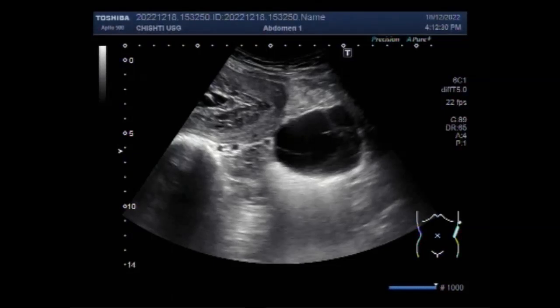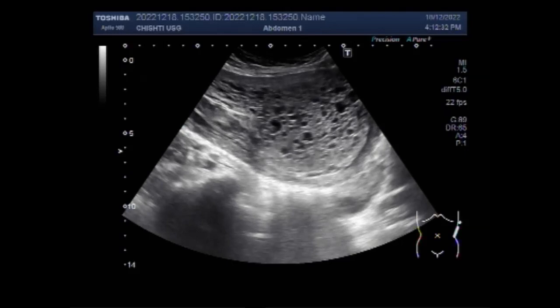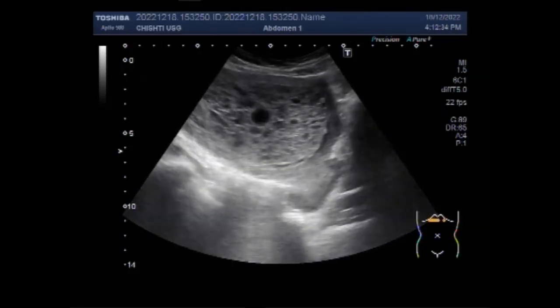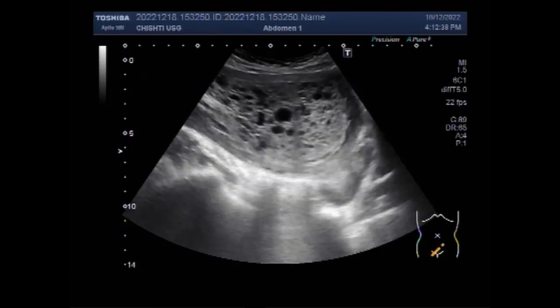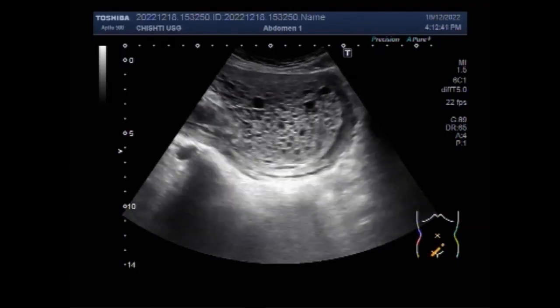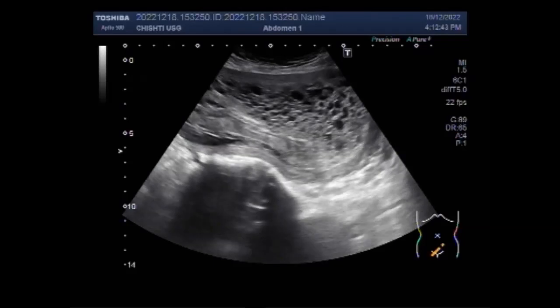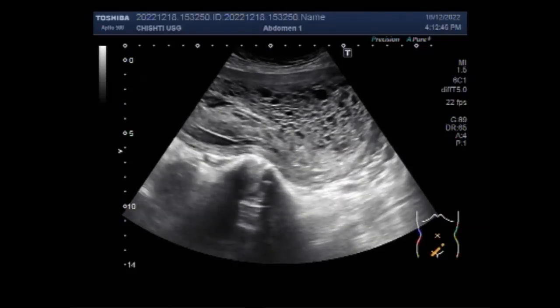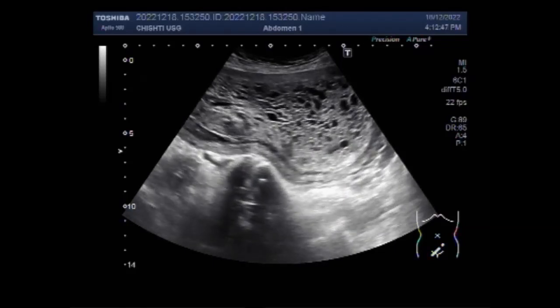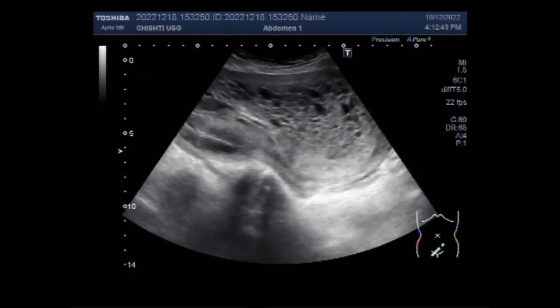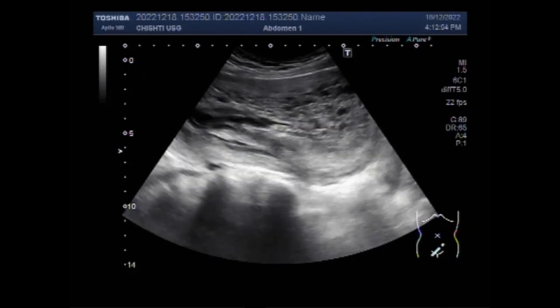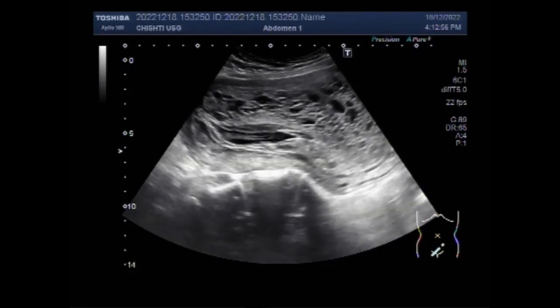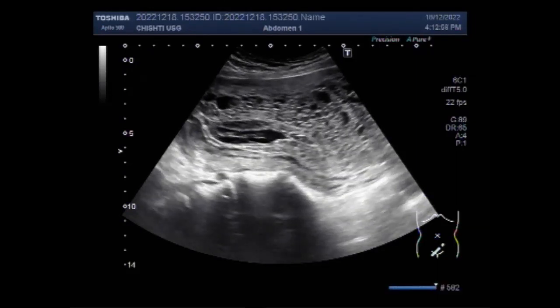Dear viewers, I hope you are all fine. This ultrasound video shows a case of complete hydatidiform mole, also called molar pregnancy. You can see the scanning of the uterus, and the whole length of the uterus is filled with this molar pregnancy from the cervix to the fundus. The normal uterine parenchyma is very poorly and hardly visible.